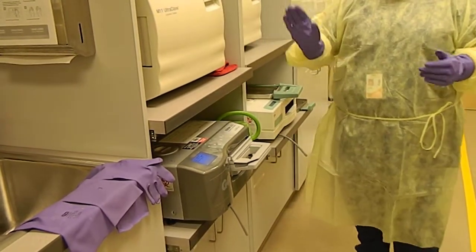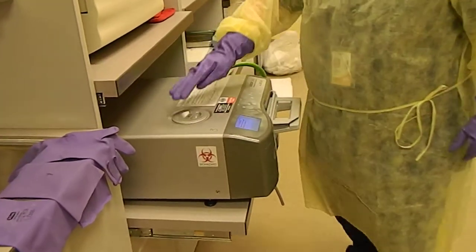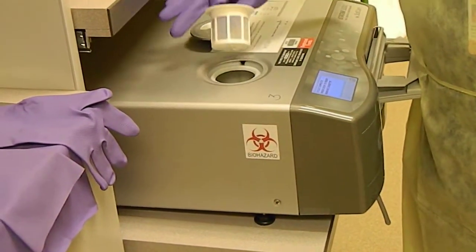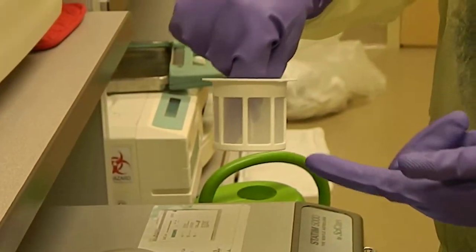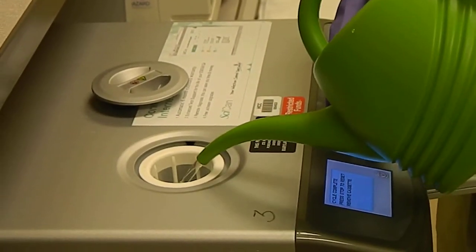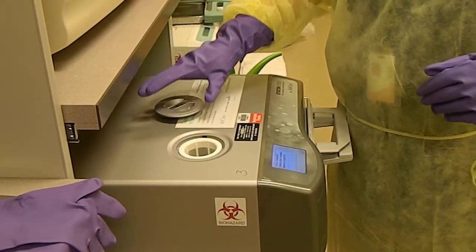Just like with the autoclave, you need to check the water levels first. To do that, we pull this out carefully — there is a little cover with a filter, and inside you can look and see how much water there is. You want it filled so that the water is touching the very bottom of this filter. I have my distilled water here — it must be distilled water — and I'm going to pour in enough water to fill this up. You can see it touching the base of the filter, and you can always double-check by pulling it out again, then replace the cover.